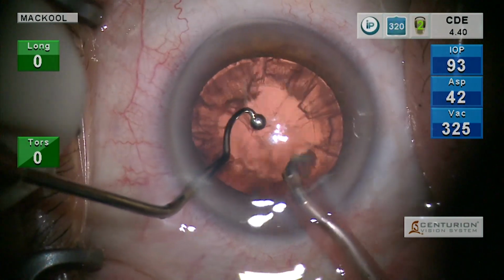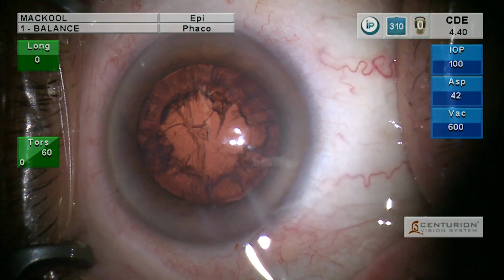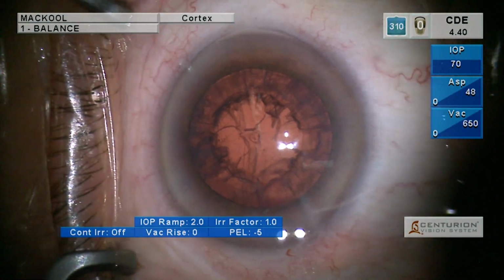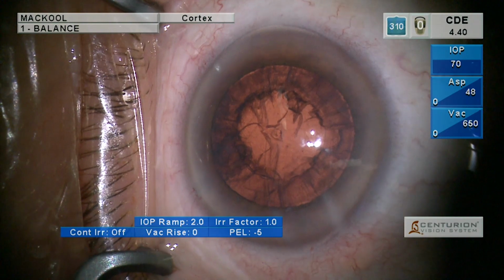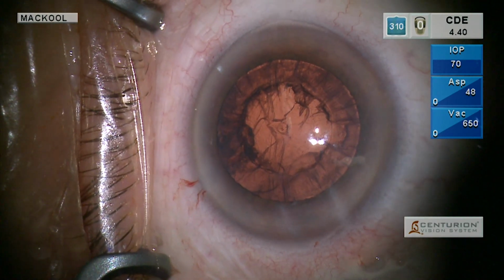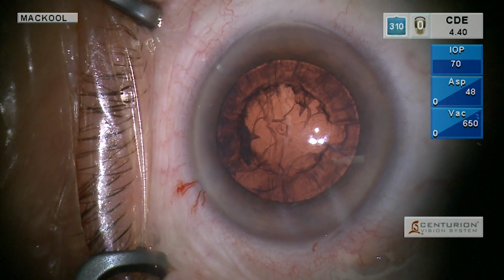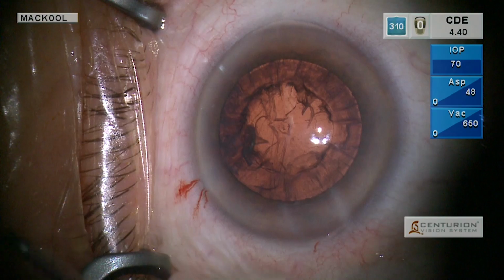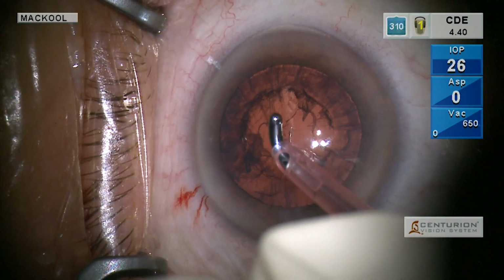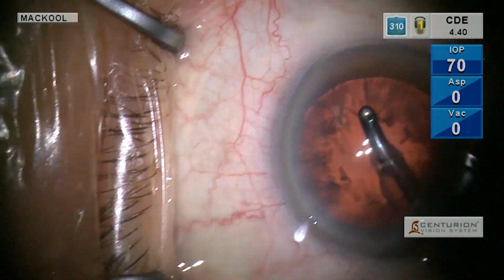You know, burst mode was programmed into the phaco machine in order to make it mandatory that you couldn't get continuous ultrasound unless you really wanted it. But that doesn't mean you can't do it whenever you want, just by intermittently depressing and releasing from position 3 to position 2.